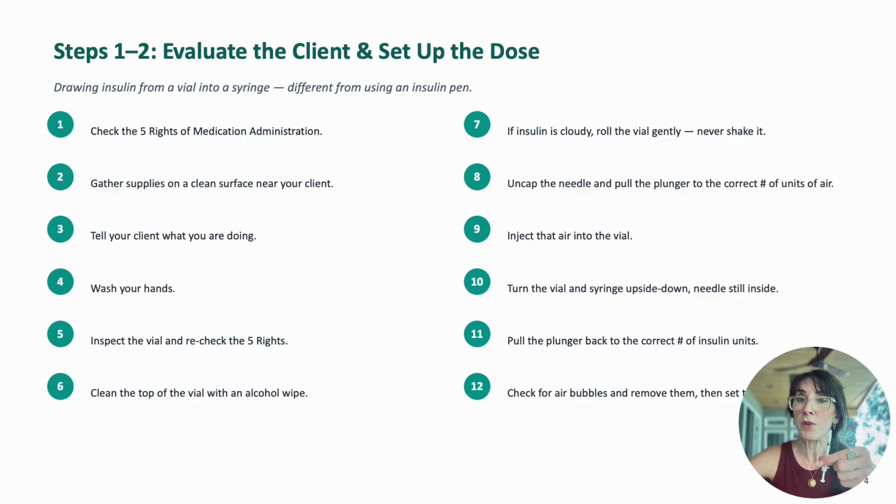You're withdrawing air. And then you're going to take that syringe and place it into the vial, pushing the air inside. That displaces the negative pressure so that when you invert it and go to withdraw your insulin, you get fluid rather than air bubbles. You're going to draw up until you have the appropriate amount of insulin, and then you can take the vial off.